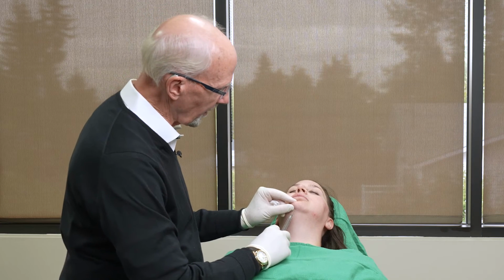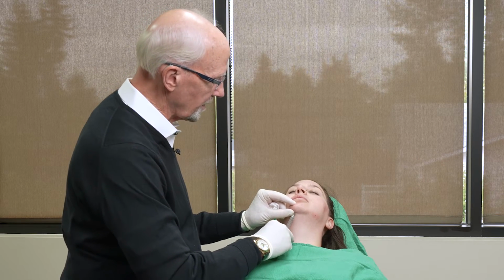So we're going to put a little bit underneath the tip of the chin just to bring this down a bit. And we're going to put 0.2 cc's on either side of the symphysis of the chin, of the mandible, in order to bring this down evenly.